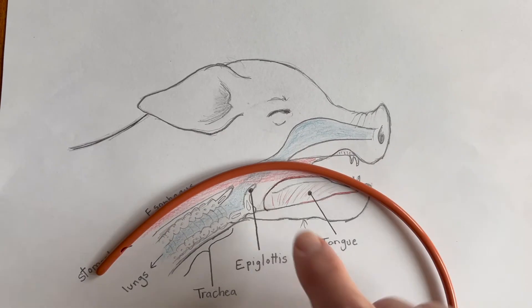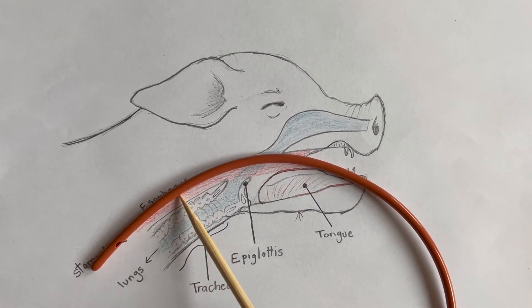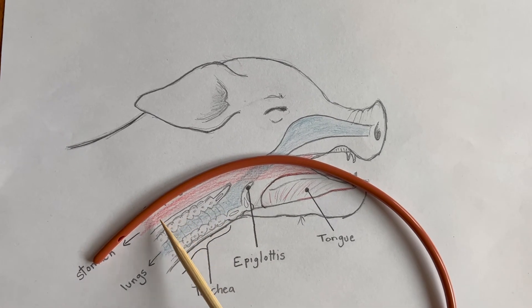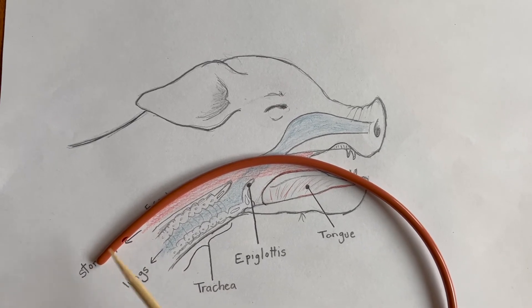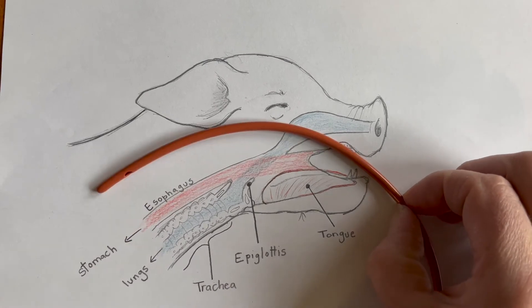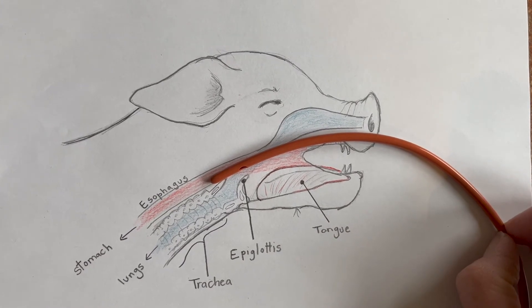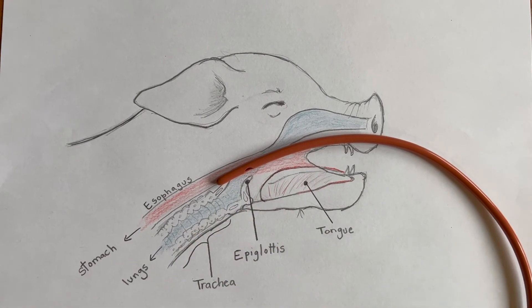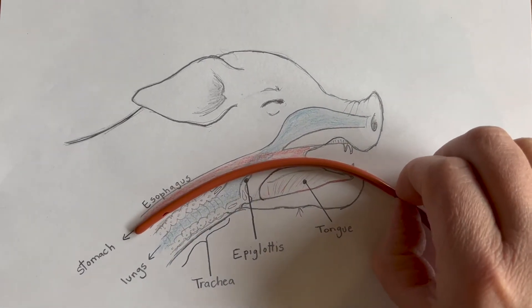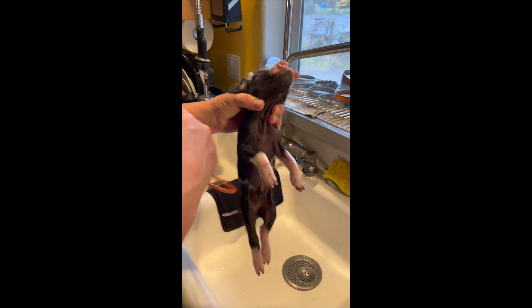Once they start swallowing just keep pushing it down and through into the stomach. Once you get there you're safe — you're past anywhere where the air is. If you overfill it can start backing up, but that's unlikely if you're using reasonable amounts of fluid. The feeding tube deposits it way down in the stomach. When you're done, pinch the tube off with your fingernail so that when you're bringing it back up it's not leaking milk, which could end up going into the lungs. Pinch it and pull it out as quickly as you can.